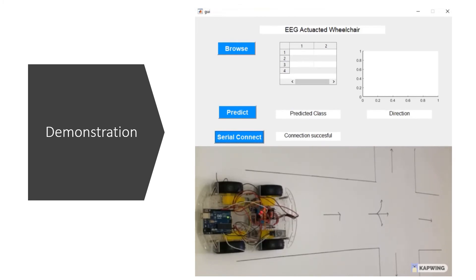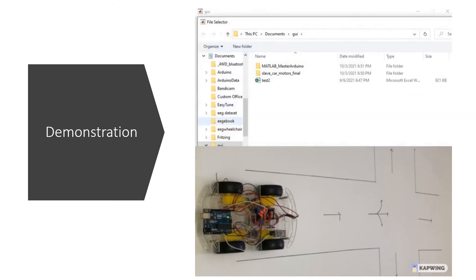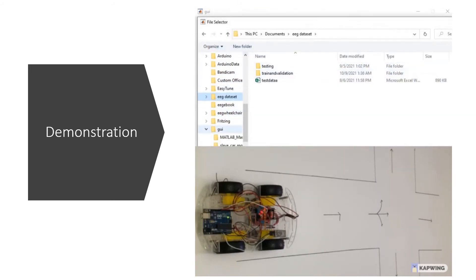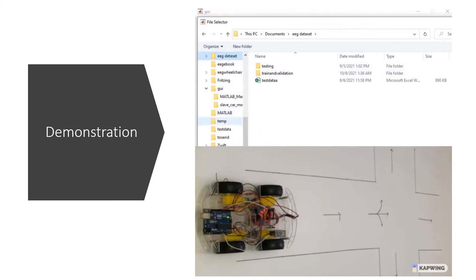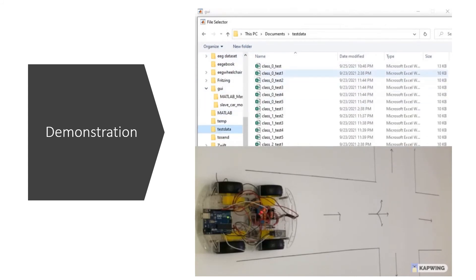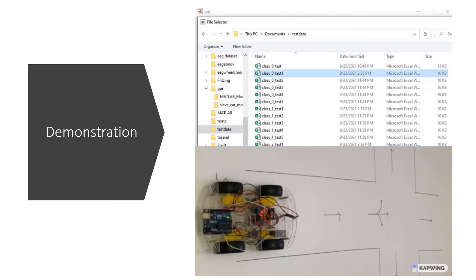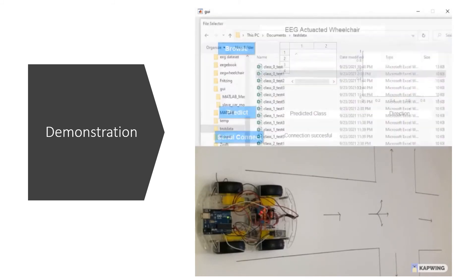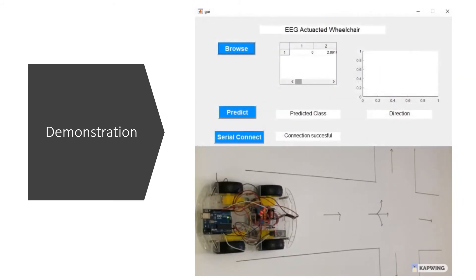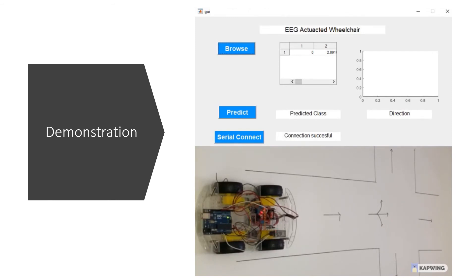After that we can use the Browse button to browse for any input data we want to test for the class of the data. Let's say it's class 0 which will actuate the wheelchair to move forward. After we input, the table here will show the value of the signal that we just input. After that we can predict the class of the data by using the predict function.